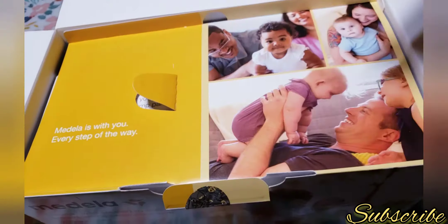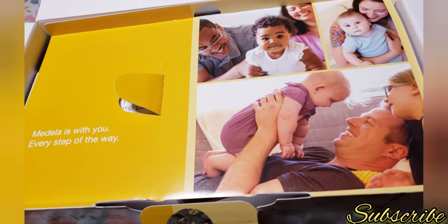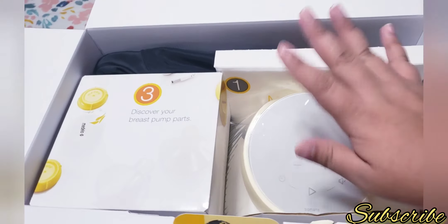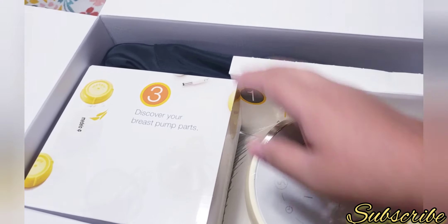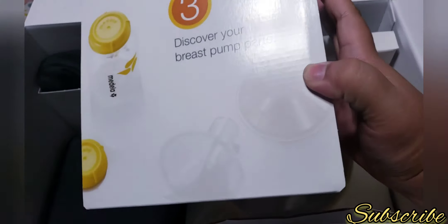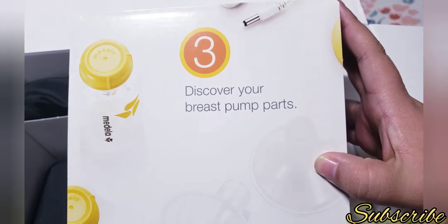It's just paper for you to know how to use your breast pump, and this is how it looks — so pretty. You just open this little tab and when you open it you will see the breast pump. In here it comes with this box that says 'Discover Your Breast Pump Parts.'